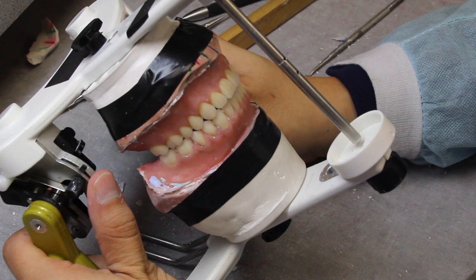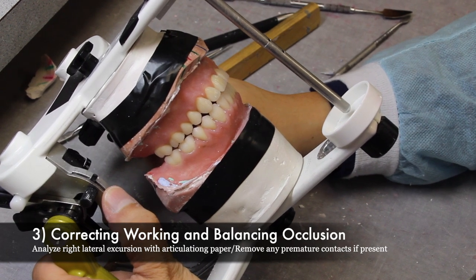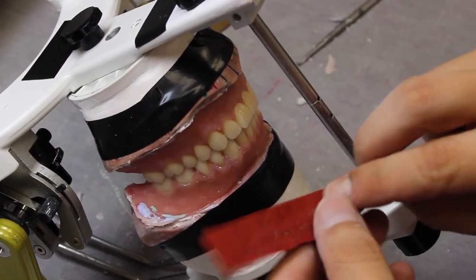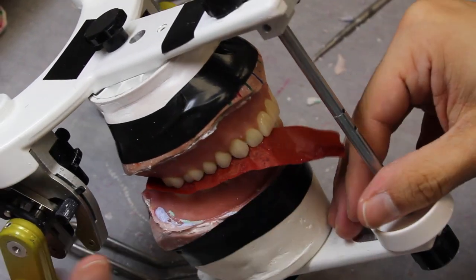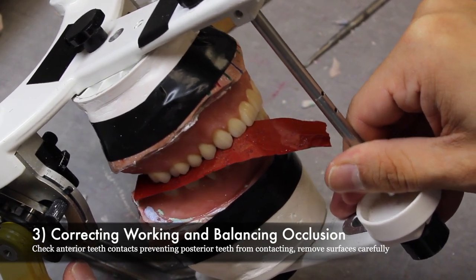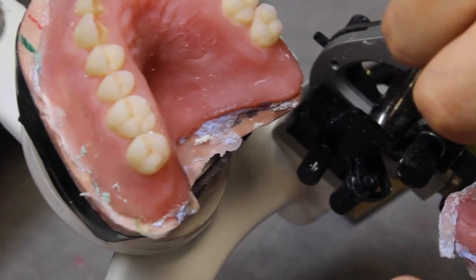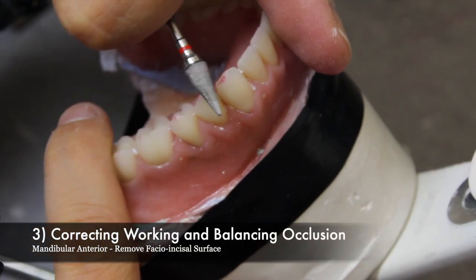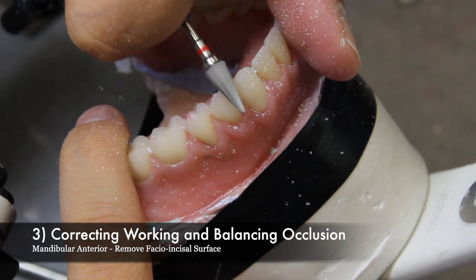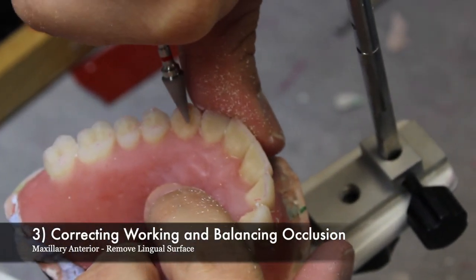Once the occlusal vertical dimension and centric occlusion is restored, it is time to correct the working and balancing occlusion. To begin, we start with analyzing right lateral excursions with articulating paper and removing any premature contacts if present. When checking the lateral excursions with articulating paper, check the anterior teeth contacts that might be preventing posterior teeth from contacting and remove those surfaces carefully. On the mandibular anterior teeth, you will remove the facial incisal surfaces, and on the maxillary anterior teeth, you will remove the lingual surfaces.